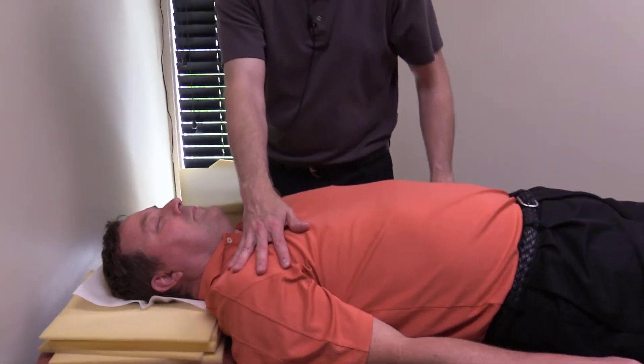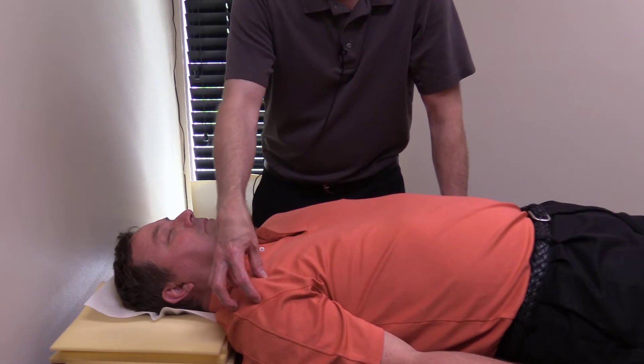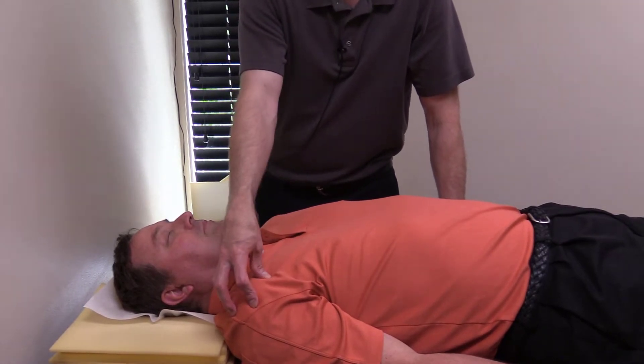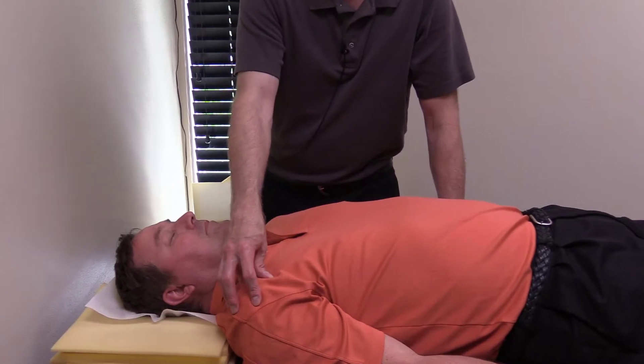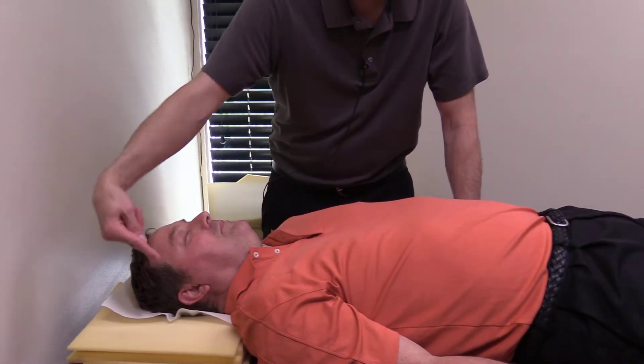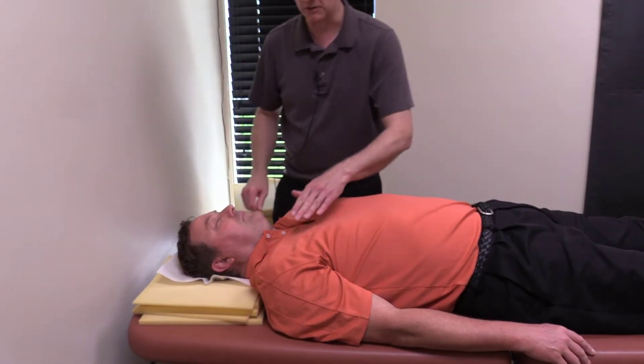This is a position I would get people in, especially if they have pain over the AC joint or just in this general vicinity. It's a little easier to get them when they're on their back versus sitting in a chair, but in the chair this can be done too — just sitting and putting the laser straight there, straight down, and straight from the back.